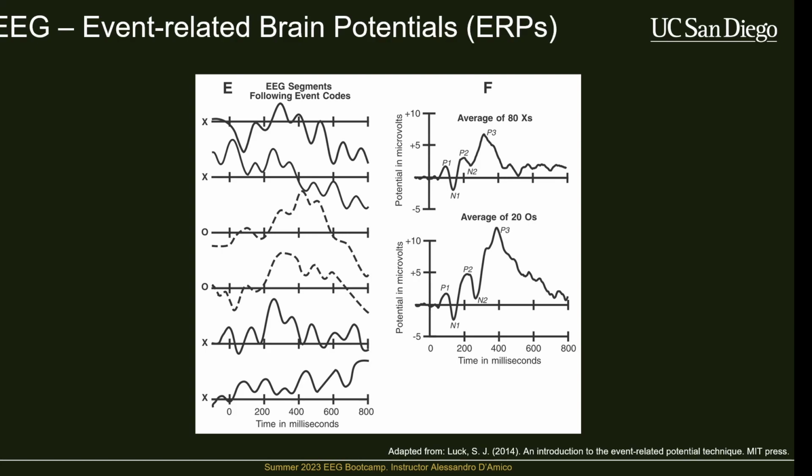People use modern machine learning approaches to go from unbiased ERP labeling or component labeling towards explaining what the response was or what the stimulus was. So sort of taking the backwards approach of taking EEG and determining which event happened. It's like, during this time period, let's call it an arbitrary component name, that's the one that explains the most of what happened. The short answer is yes, people are doing this. It has mixed effectiveness. One of the main problems is that it's hard to get enough data for these more complex models to confidently make these predictions.